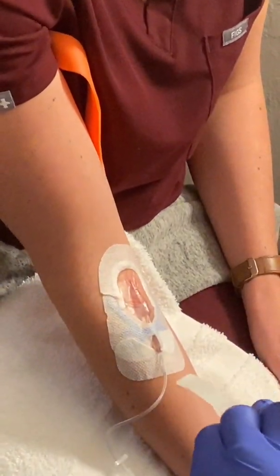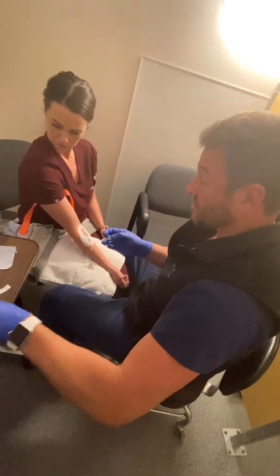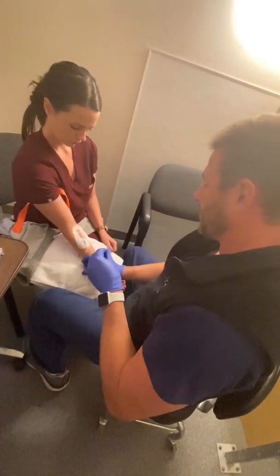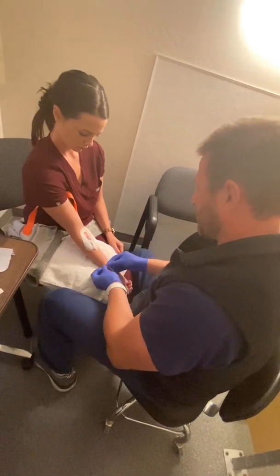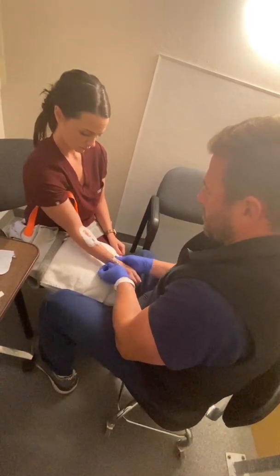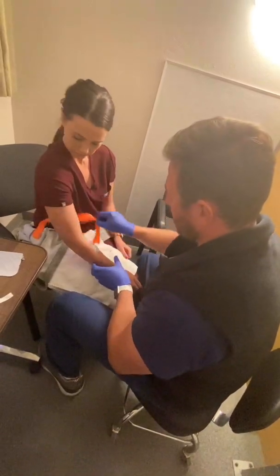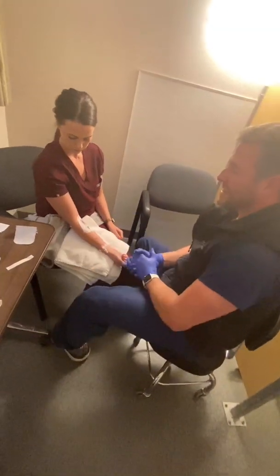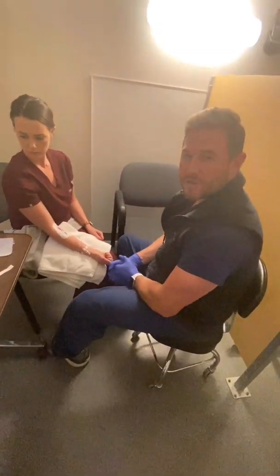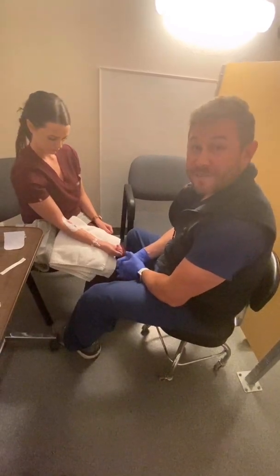And there's really no right way to tape an IV. It's your preference, but just make sure that it's secure and it's not going to go anywhere. And of course you would time and date it and put your initials on it, but for this purpose we're not doing that for instructional reasons. But that's how you insert an IV.